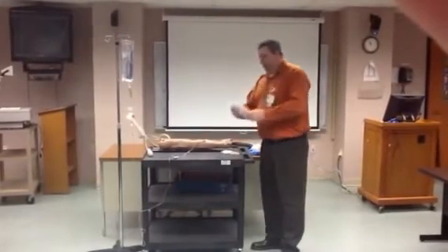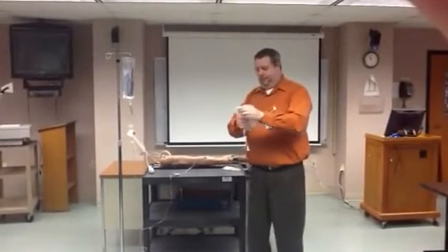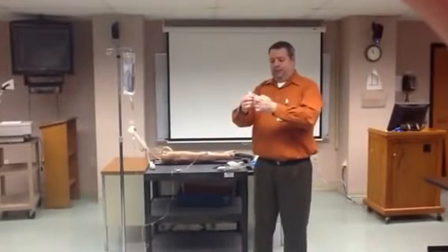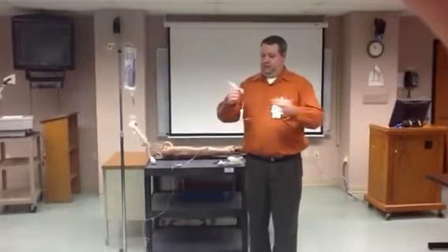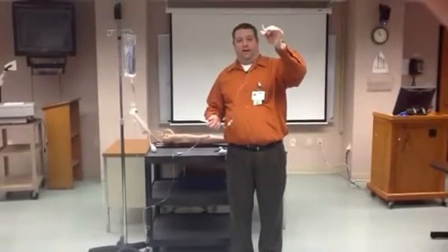Now I'm going to open up my secondary tubing. The first thing I want to do is close the roller clamp. This end is going to go into the IV bag, and this end is going to go into the IV tubing.